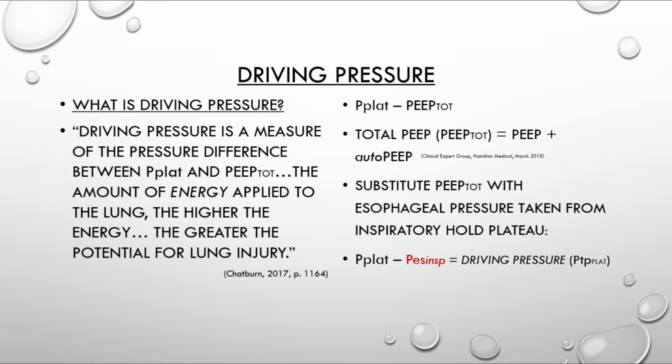So what is driving pressure? Driving pressure is a measure of the pressure difference between plateau pressure and total PEEP. You can think of it as the amount of energy applied to the lung. So the higher that energy is, the greater the potential there is for lung injury.